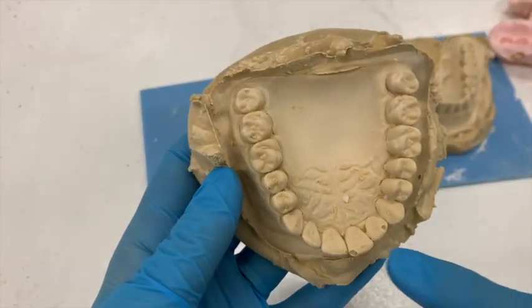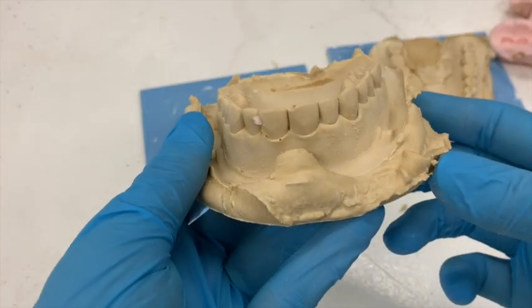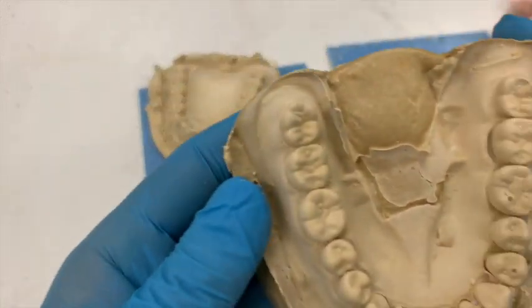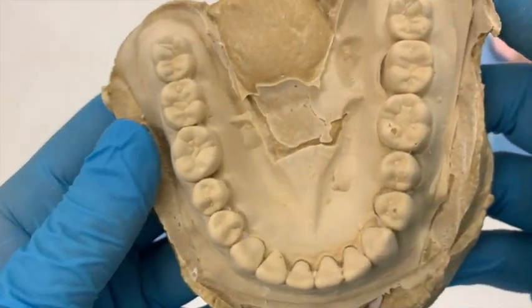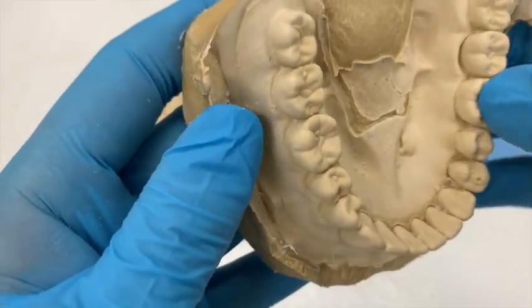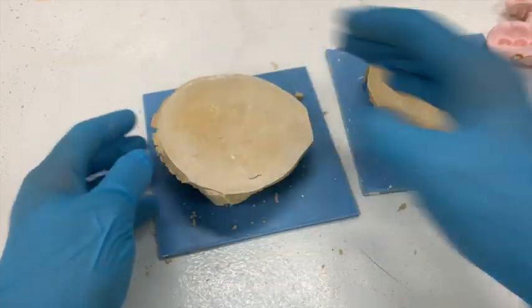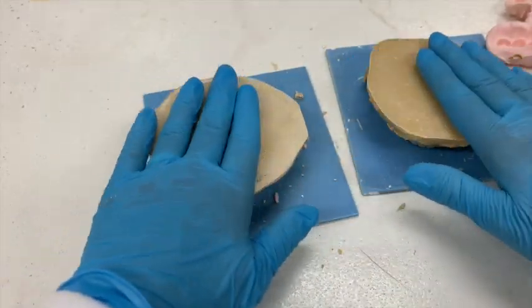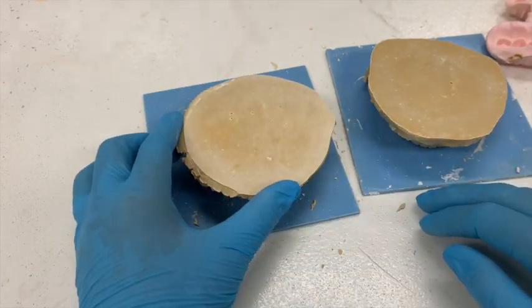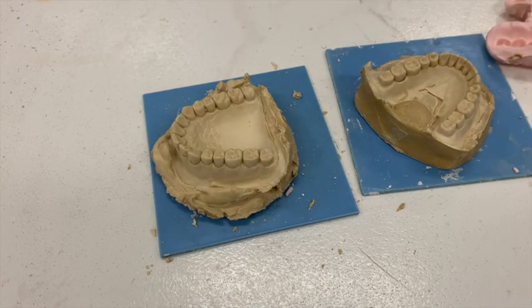Ooh, that doesn't look good — we don't want those bubbles. But aside from those two bubbles, that is looking pretty good. Let's take a closer look. This one's looking good, just a couple of small bubbles on the occlusal. We also want to check that they're fairly flat to the table — we don't want any tilt or takeoff. So we want them to be fairly flat, and that's what we're looking for.